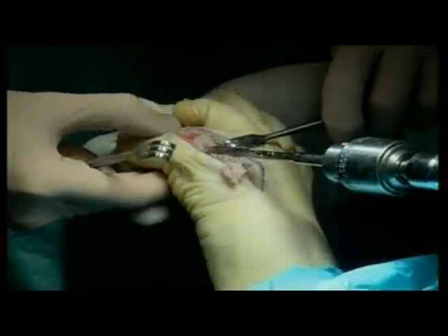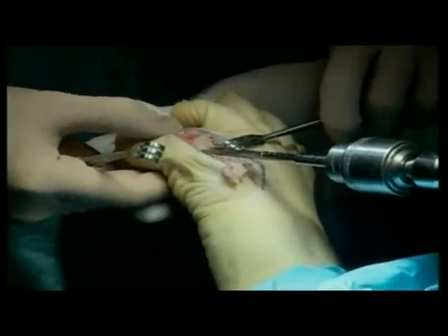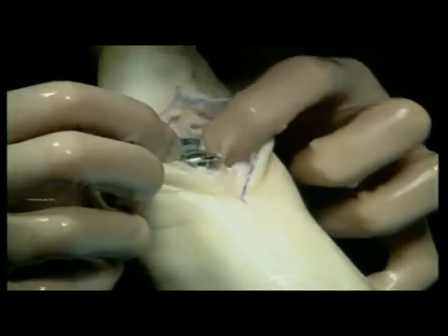The following case will guide you through the step-by-step reaming technique and placement of the Reflection First MPJ implant.